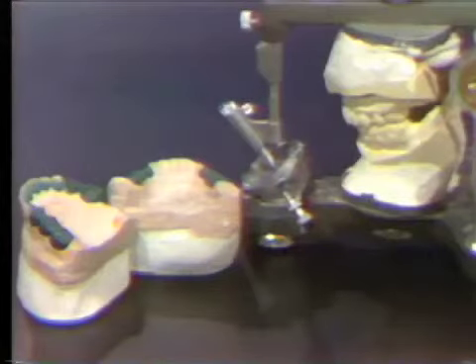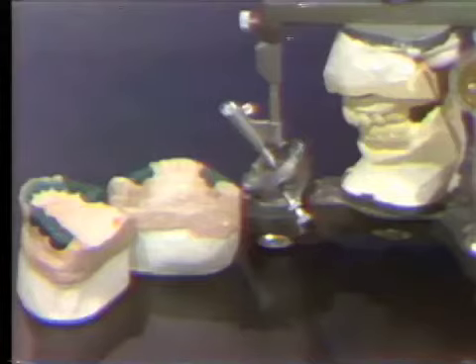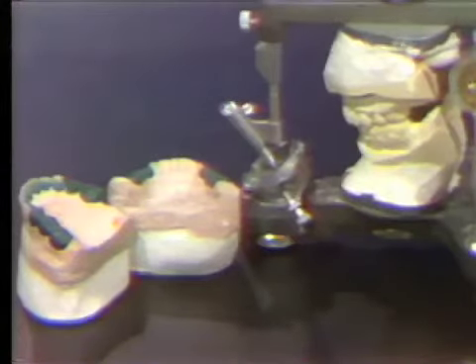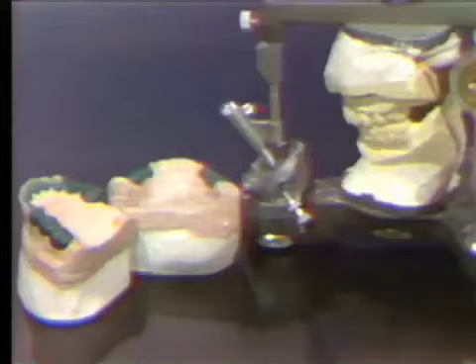In this case, we have already done the diagnostic workup. We have the initial study cast mounted on the articulator, and we've done occlusal analysis, occlusal adjustment, and occlusal splint. We even have our diagnostic wax-up completed. The diagnostic wax-up can be sent to the commercial laboratory, and they can do it for you. In this case, the diagnostic wax-up is complete.